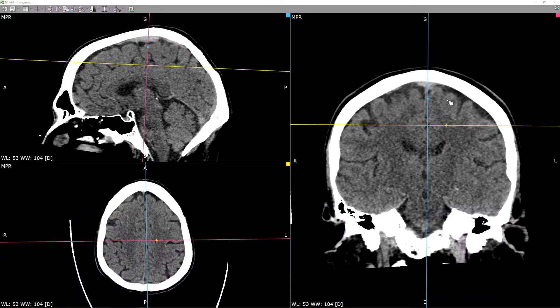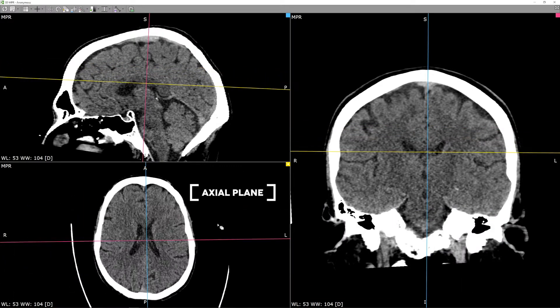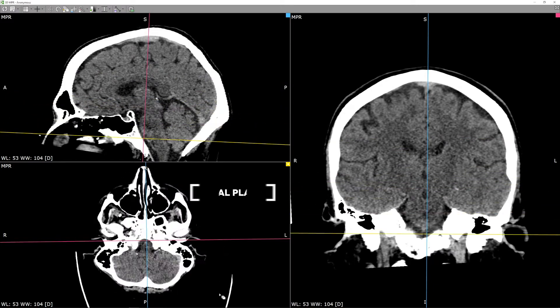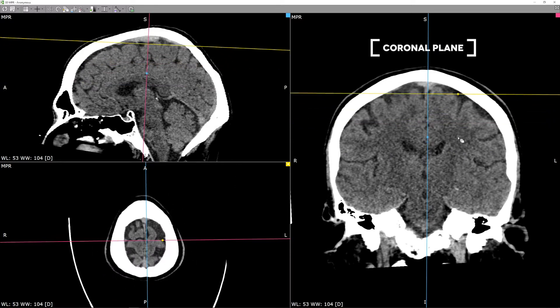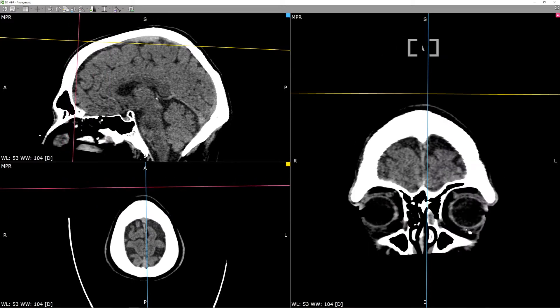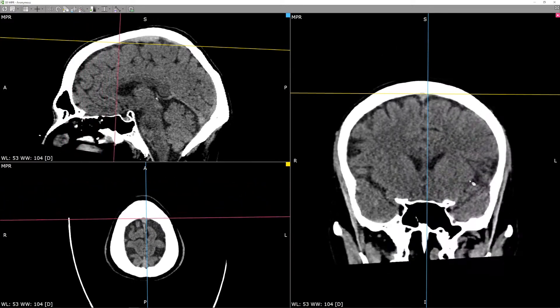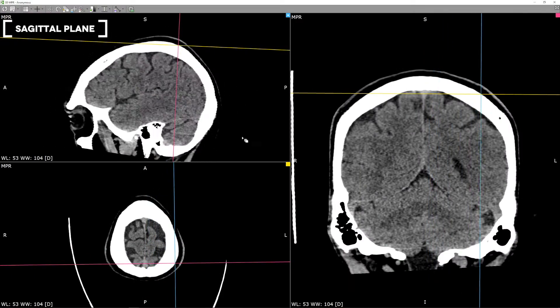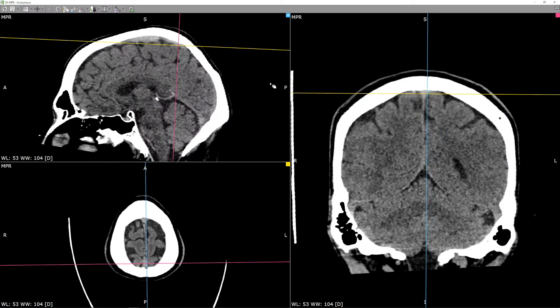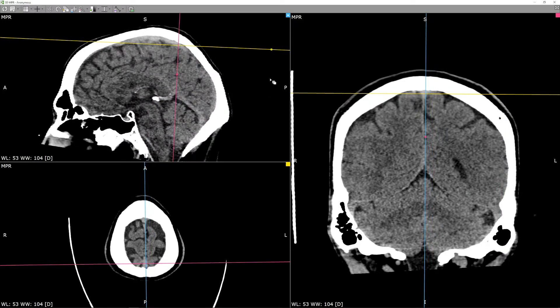We look at the brain in three planes: the axial plane, shown here on the bottom left; the coronal plane, shown here on the right of the screen; and the sagittal plane on the top left. This is called multi-planar reformatting or MPR. The axial plane is the most common plane for primary assessment, and in some institutions this may be the only one available.